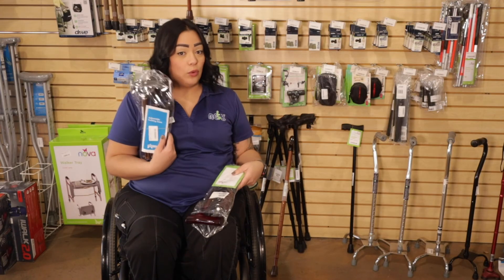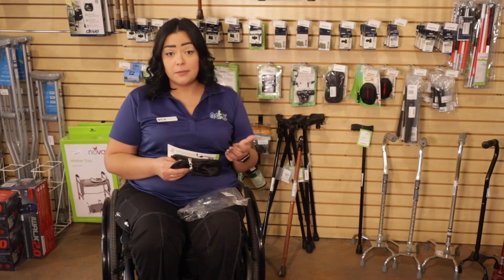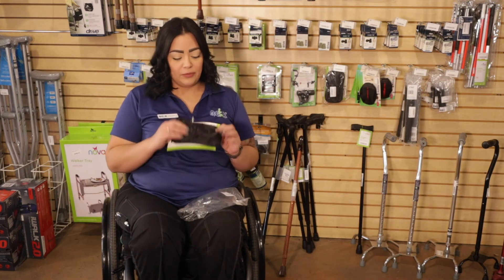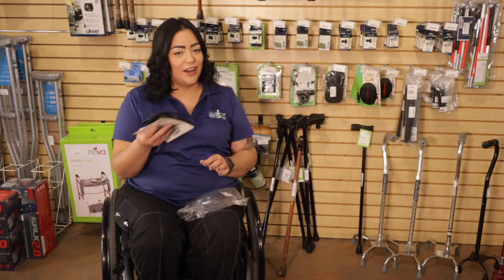On the one point, we also have folding ones in different colors as well. We also have the accessories for your canes — we have the tips in different colors and different sizes. We have a bag that you can put your phone in, your car keys, you name it. You can attach it to the cane on the go.